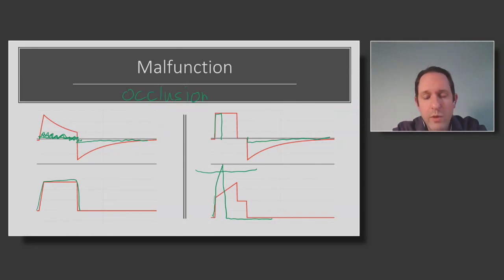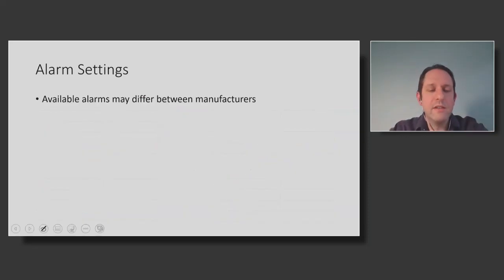And when you have alarms like this, occlusion or vent malfunction, the patient clearly needs to be taken off the ventilator and bag mask ventilated, and then really assess the ventilator, seeing if you can troubleshoot. We don't often keep test lungs at bedsides. So sometimes if you have another ventilator somewhere that can be circuited and brought over, it's sometimes best to do that and then investigate and test the ventilator elsewhere rather than putting it back on the patient and hoping it doesn't happen again.